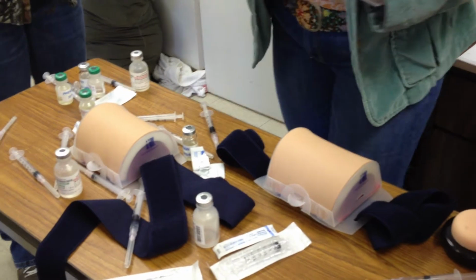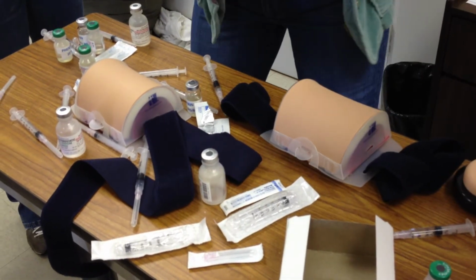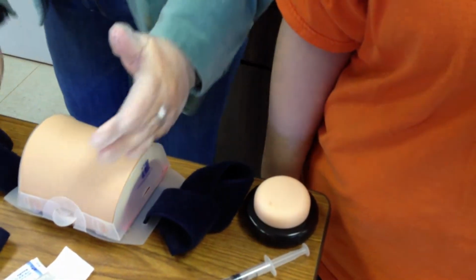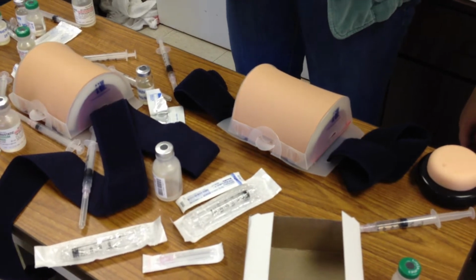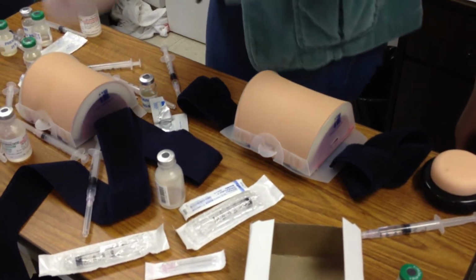Okay? So this is my deltoid. I've identified my medication. We're ready to go. Got my gloves on. Will somebody grab me an alcohol pad from over there? I need one to clean. There we go. Just grab me several, because you guys are going to practice up here in just a sec. And I've got plenty. I'll go get us some replacements. There you go. Thank you.